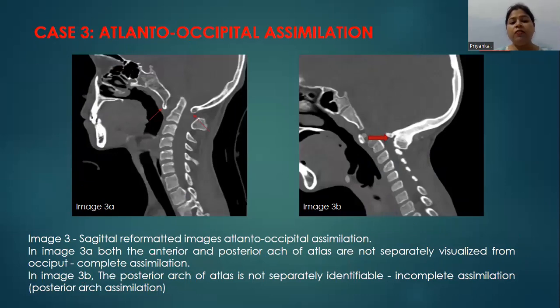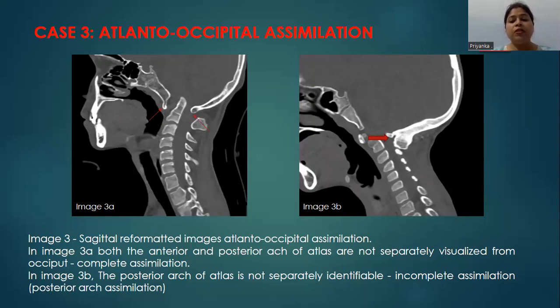These are sagittal reformatted images demonstrating atlantooccipital assimilation. In image 3A, both the anterior and posterior arch of the atlas are not separately visualized from the occiput, suggestive of complete assimilation. Whereas in image 3B, only the posterior arch of the atlas is not visualized separately, indicating incomplete assimilation — that is, posterior arch assimilation.